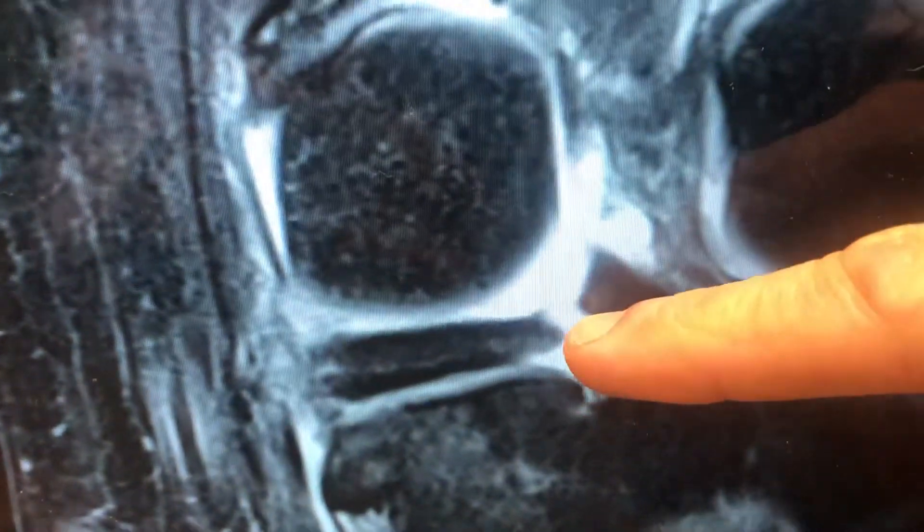But if we follow the meniscus tear towards the back of the knee, this is what we see: a classic finding of a root avulsion. You can see the stump of the medial meniscus — it's free and floating. It should be attached to the bone. This is called a root avulsion of the medial meniscus.